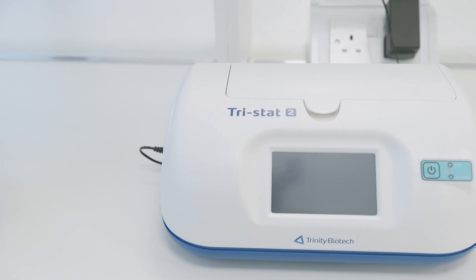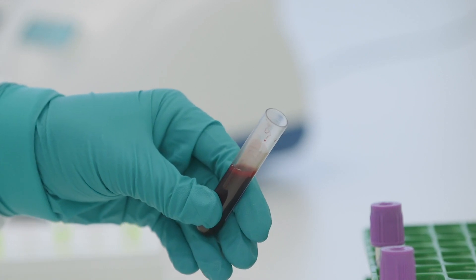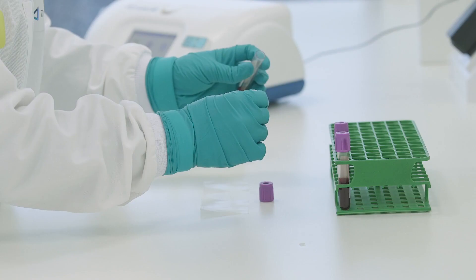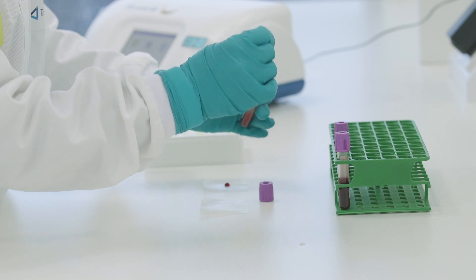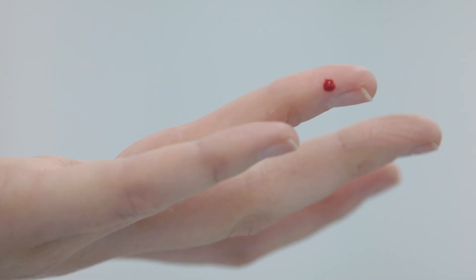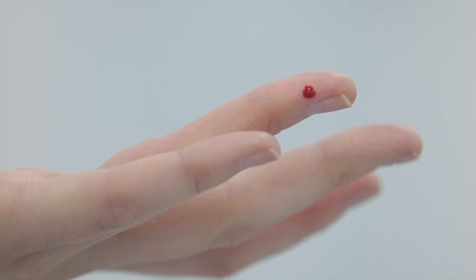The Tristat 2 measures the percent of glycated hemoglobin in fresh whole blood from finger stick or venous-drawn samples. For venous-drawn samples, place one drop of sample onto a non-absorbent surface and recap the tube. Alternatively, for finger stick samples, use a lancet device to draw a drop of blood from a patient's fingertip.